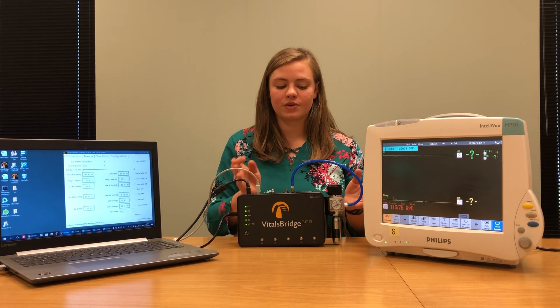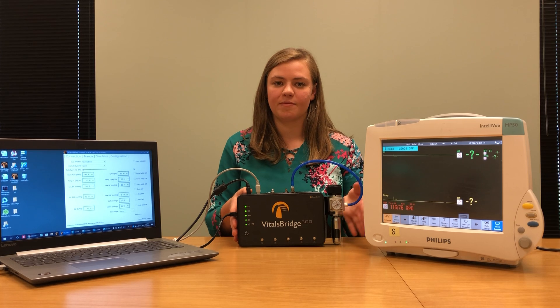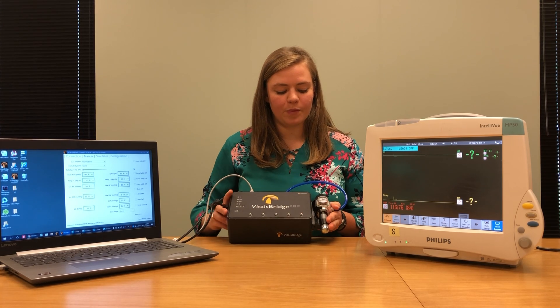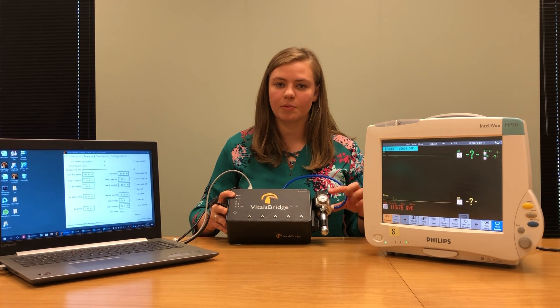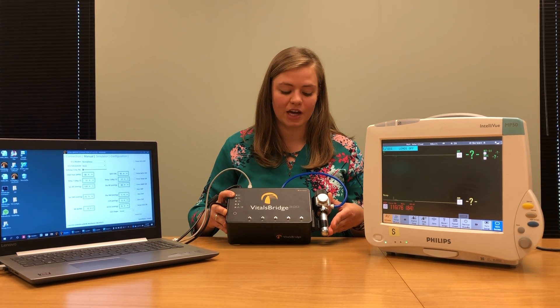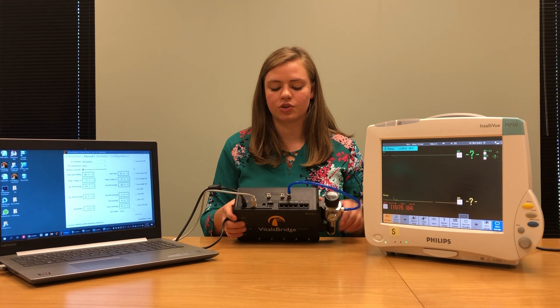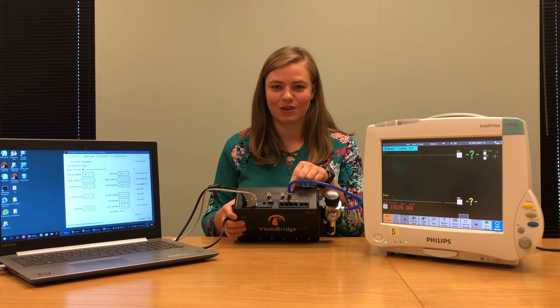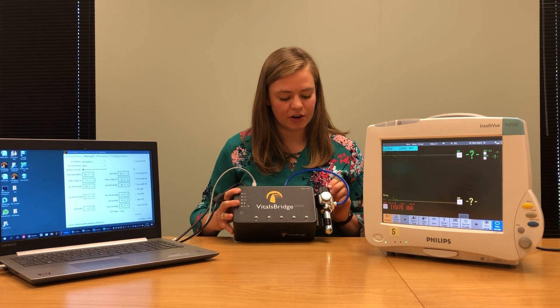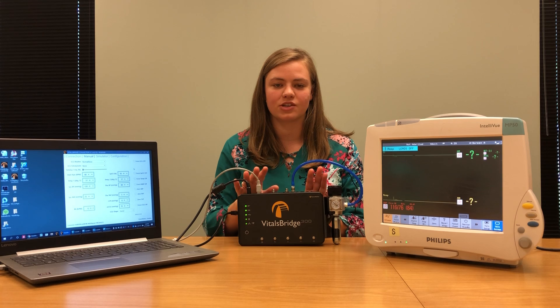Before beginning, I also connected a carbon dioxide supply system to my VitalsBridge. I connected the VitalsBridge carbon dioxide cartridge which was included with my VitalsBridge. I was able to attach the carbon dioxide canister to the carbon dioxide regulator by following the instructions downloaded from VitalsBridge.com/downloads. After connecting these two pieces together, I took this blue tube and connected it to where it says CO2 in on my VitalsBridge.